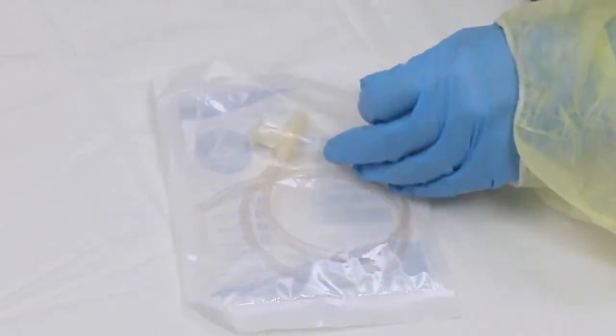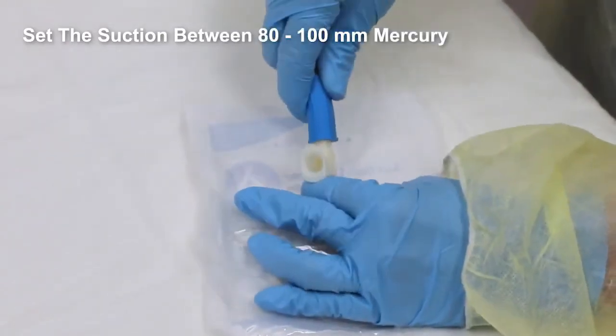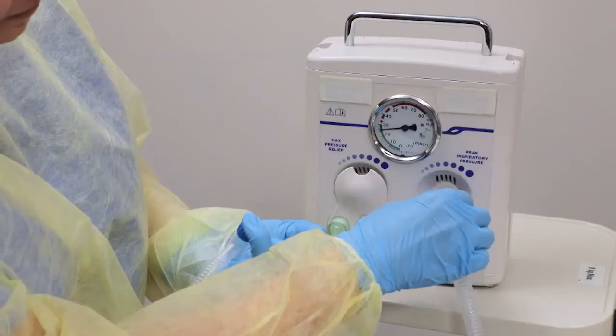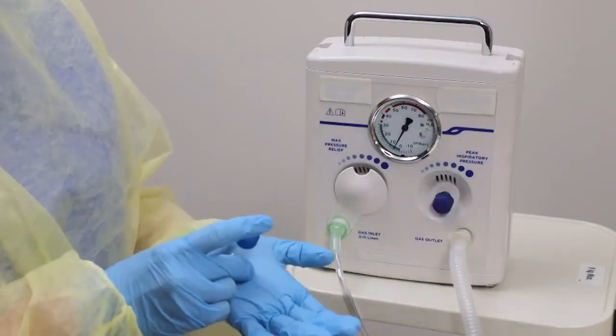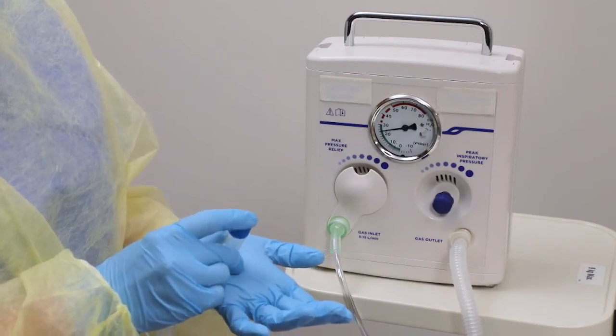Occlude the suction tubing and set the suction between 80 to 100 millimeters mercury. Connect a 10 or 12 French suction catheter. Make sure the PPV device is present and functional. This team is using the T-piece resuscitator.